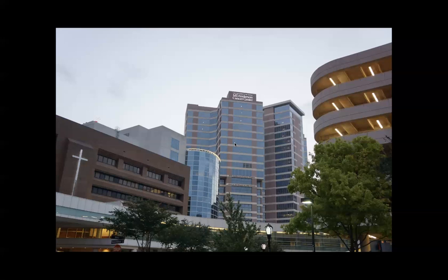Who says that they can cut it in one piece? They may not even be able to see it, let alone cut it well. So I wouldn't say that what we do is necessarily less just because we use an endoscope and we are not a surgeon. We actually have the best equipment to be dealing with this.